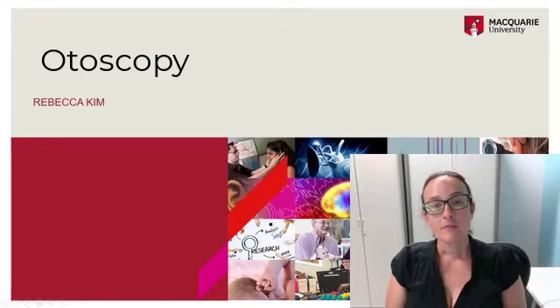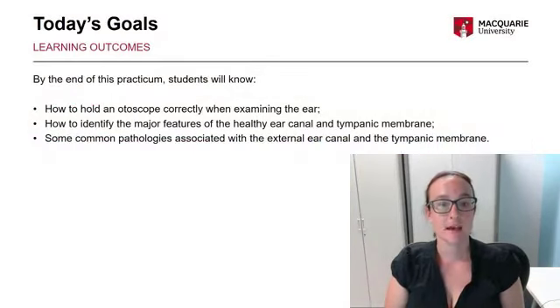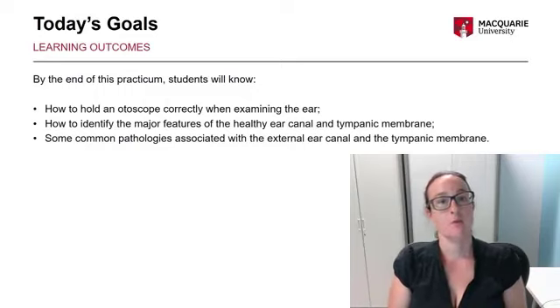Hi everyone. This is just a little brief introduction for before your otoscopy prac. I'm sure you've done quite a few exercises now with regards to otoscopy. You should have seen the video where you learn about holding the otoscope correctly and how to examine the ear. You would have worked through the 803 exercises.